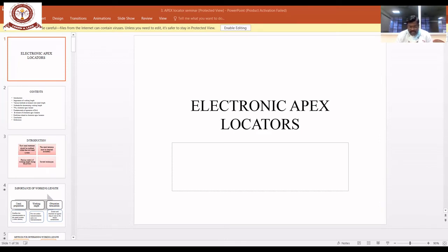Whenever we place both the positive and negative electrodes and apply some potential difference, there will be a flow of current. There are two types of current: direct current and alternating current. Direct current has a single flow of electric charges, whereas alternating current has a high crest and trough. It has an amplitude.